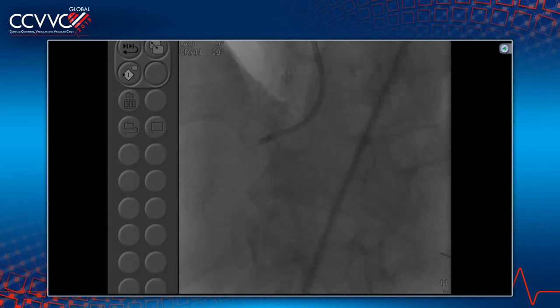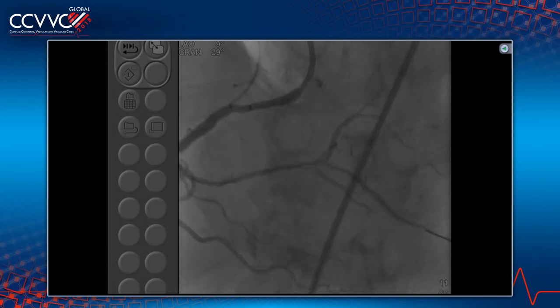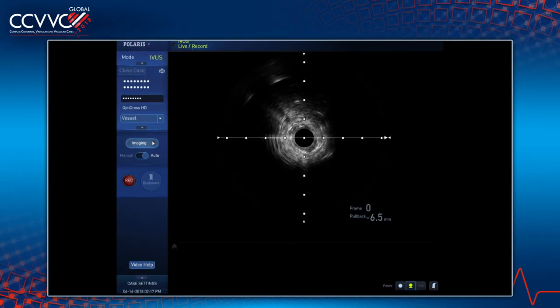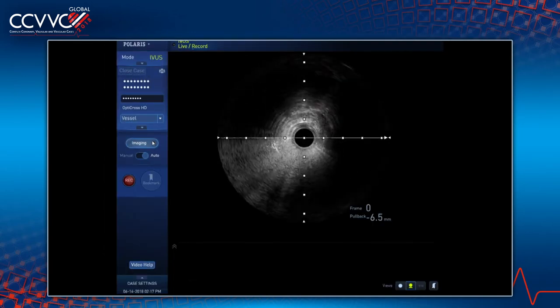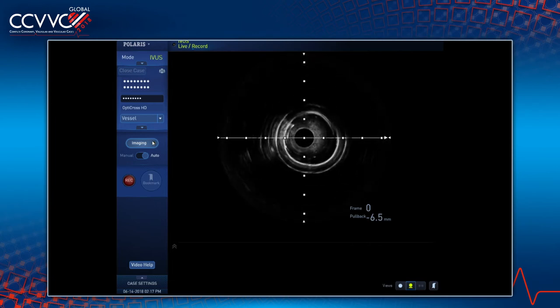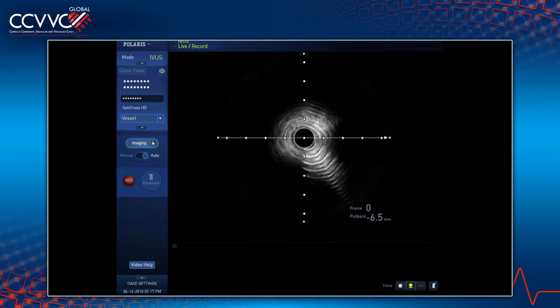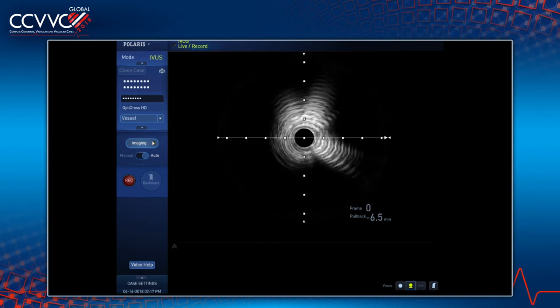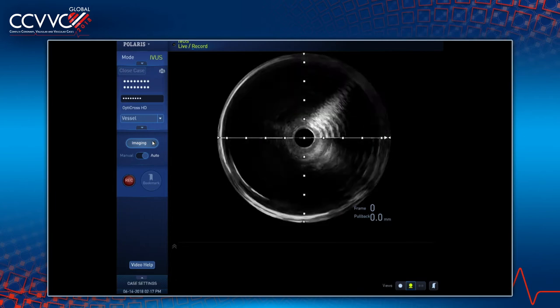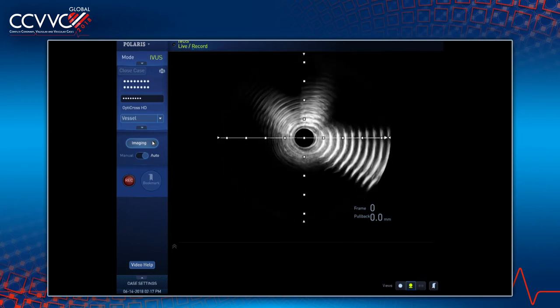I think we'll be at 3-0 to 3-5. It's going to be 3-0. Your diver's ready? Yeah, it's very long, that's for sure. So your guess is a 3-5? Maybe. You may have to bridge the old stent and go all the way there. That's another story. We put a short stent, I don't know, what length was that? 2-5, 38 in there, and another 3-0, 38 in the front.